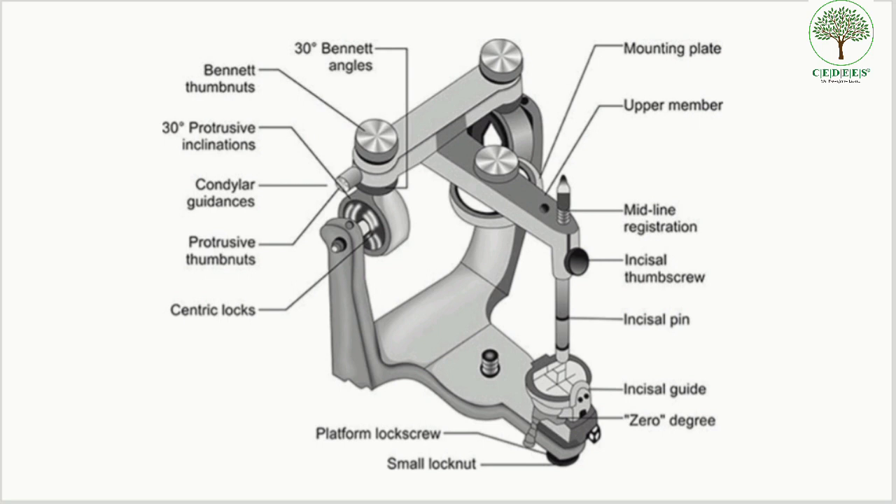We can identify where the mounting plate is fixed, where the upper member is, and what the incisal pin is. There is also an incisal guide, a platform lock screw, centric locks, condylar guidances, protrusive inclinations, and Bennett angle. All of these comprise the major parts of a Hanau articulator.